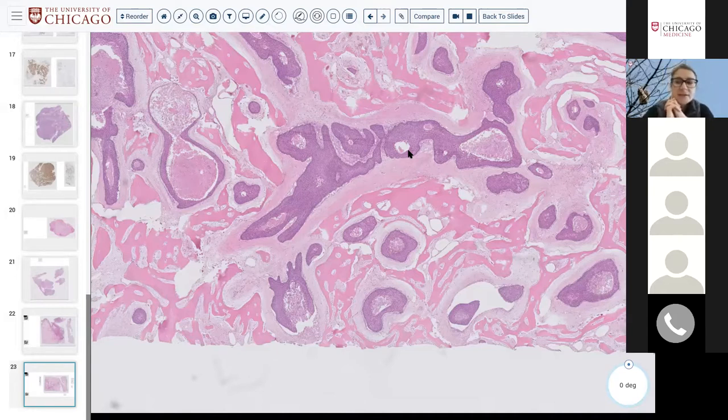That's the correct answer. So the ones that are on the lateral nasal walls like this are more commonly EGFR than HPV. The ones on the septum are more commonly HPV, and they in fact have an exophytic rather than an endophytic growth pattern, but it's all kind of splitting hairs. So the HPV associated ones tend to have an exophytic growth pattern.